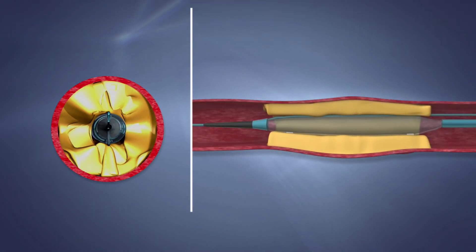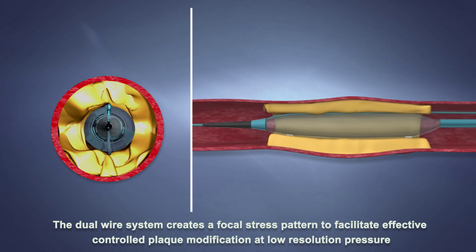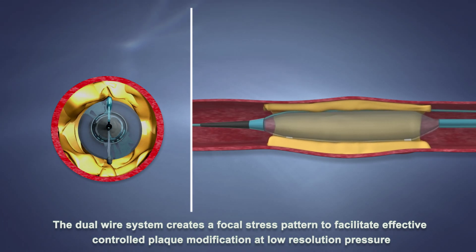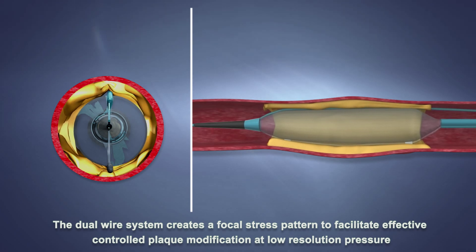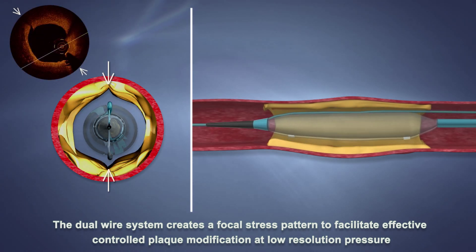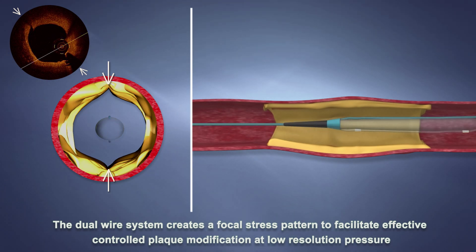During balloon inflation, the two wires create focal pressure onto the plaque on the vessel wall. As stated in the instructions for use, a step-up inflation is recommended for optimal lesion dilatation. The expansion planes along the plaque resulting from the SCOREflex dual wire balloon are clearly visible.